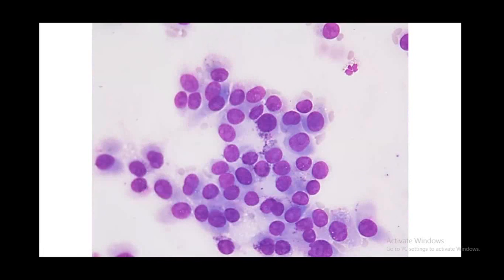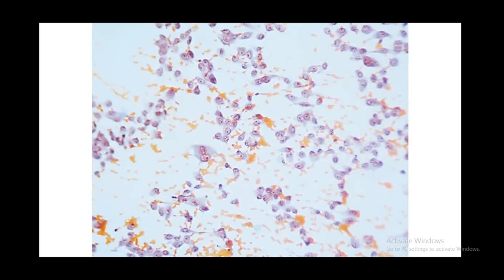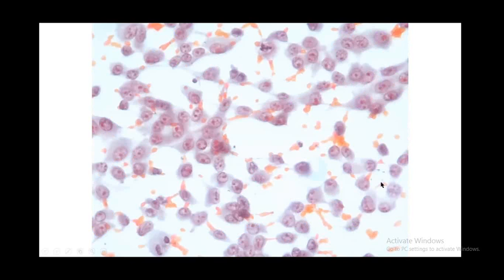Some multinucleation was seen, and on Pap smears, the nuclear atypia was much more prominent. Nuclear grooves similar to PTC were not identified. There was binucleation, and what was brought out in these Pap smears was the prominence of nucleoli. Some multinucleation can be appreciated here. Again, prominent one to two multiple nucleoli were seen.